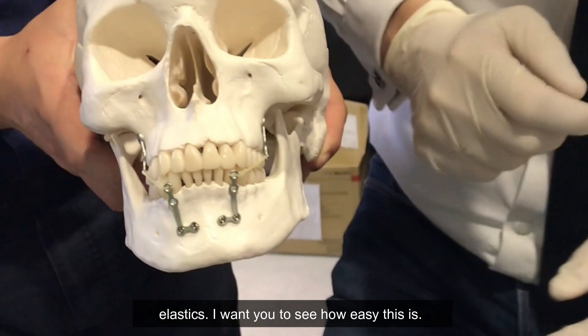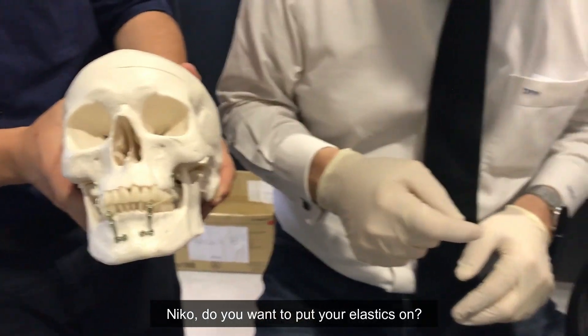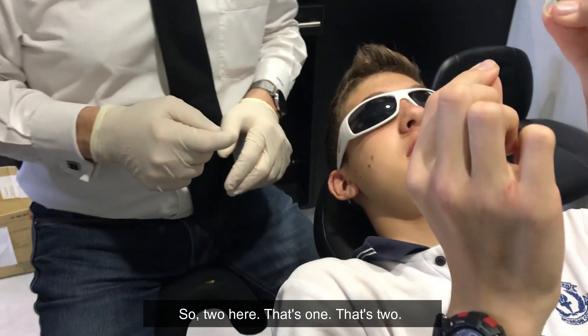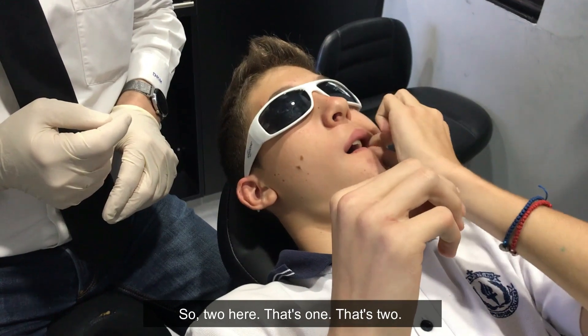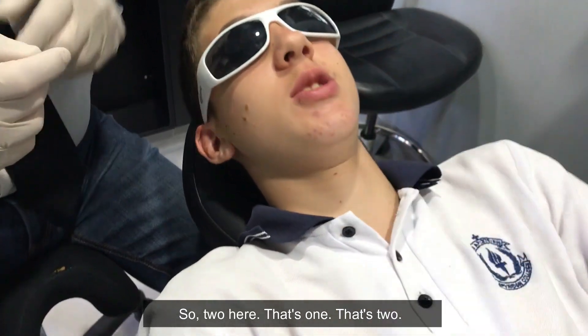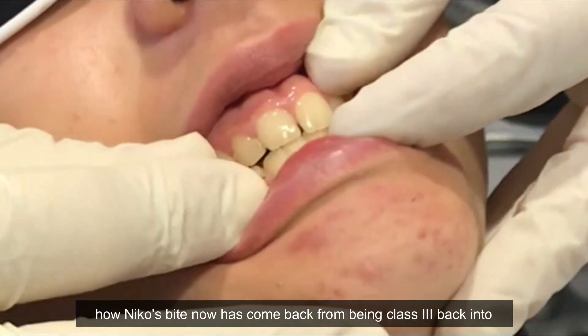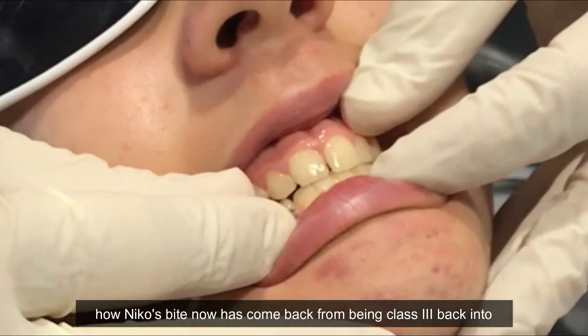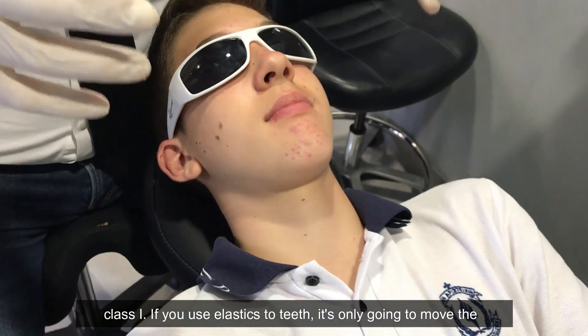The patient wears elastics. Nico, do you want to put your elastics on? That's it, great. If you have a look — bite together — and Nico's bite has now come back from being Class III back into Class I.